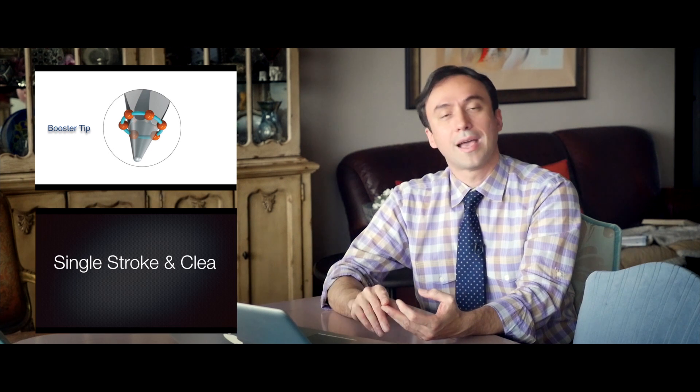Hi folks, this is Ali in SA. Now we're going to cover, after having seen the inspiration for the ESX file system from the endosequence files, the two specific features of the ESX that differentiated it: one being the incorporation of the booster tip technology, and second being the new SSC — single stroke and clean — motion with all the ESX files.